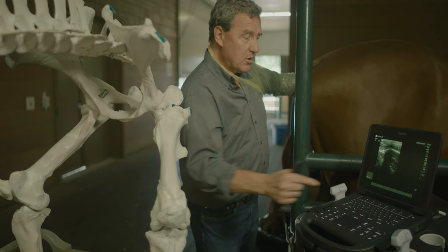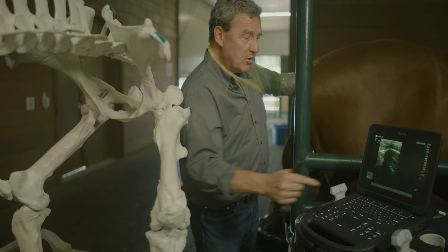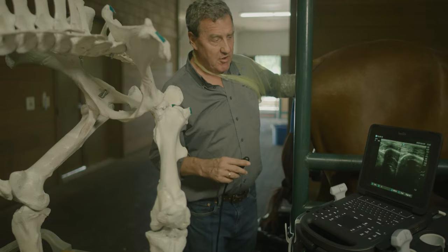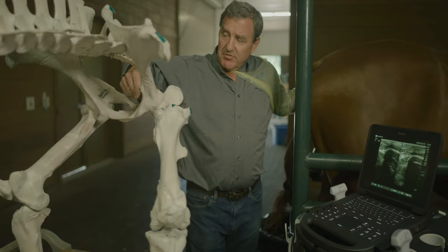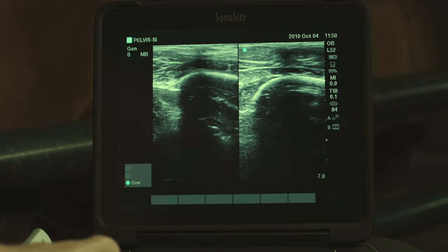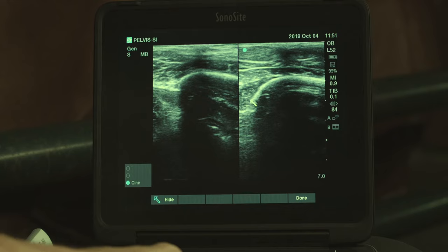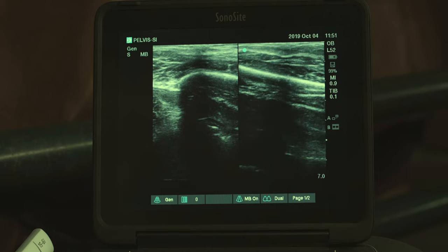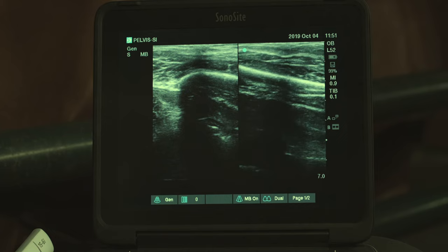What I will do now is freeze one image and go to the other side of the screen. I usually do each half on each side of the screen — right on the right side, left on the left side. I'll freeze that and you can see as I move my arrow up the cranial edge as it goes into the obturator foramen. Then we'll go back to the caudal edge of the ischium table.